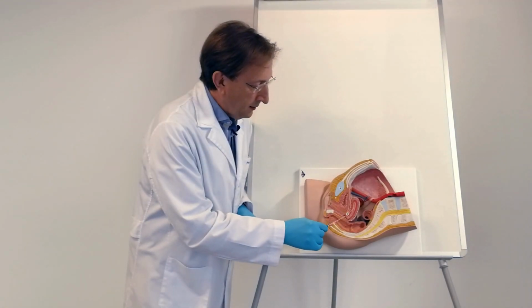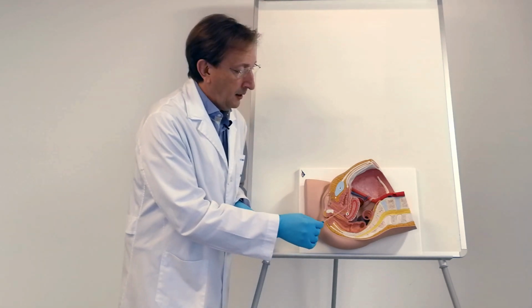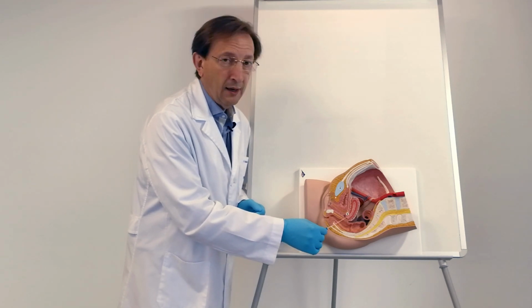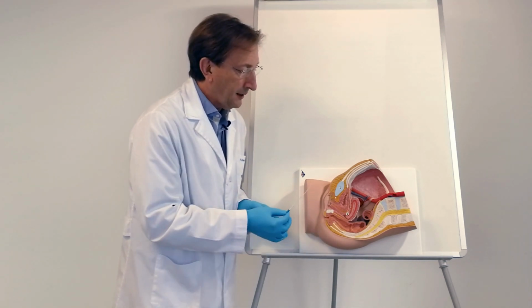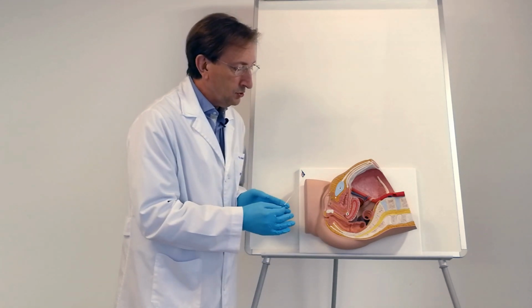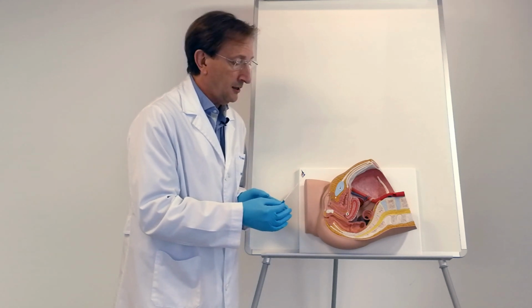The uterine cavity is a virtual cavity that contains the endometrial fluid. The average volume of endometrial fluid that we expect to obtain from the uterine cavity ranges from 10 to 50 microliters. And this is the liquid that we need to collect so that we can analyze both the human RNA and the bacterial DNA that we need for our endometrial receptivity test.